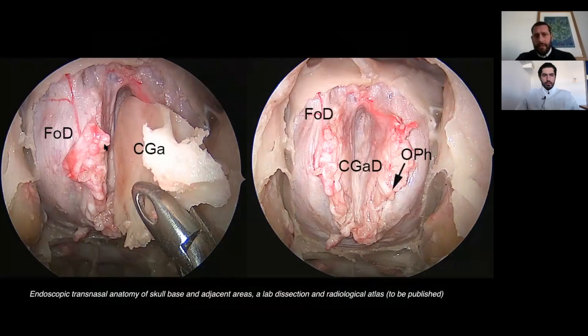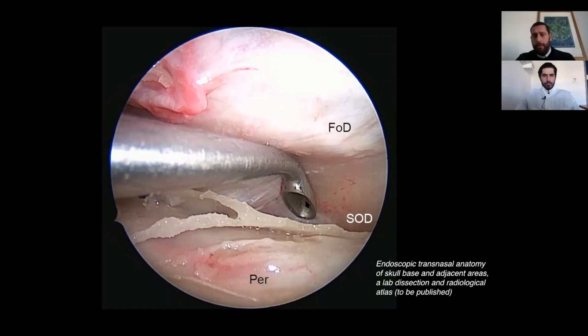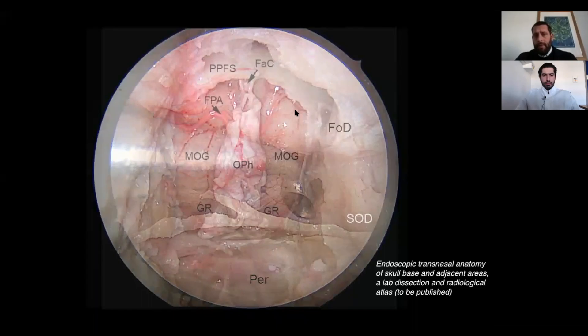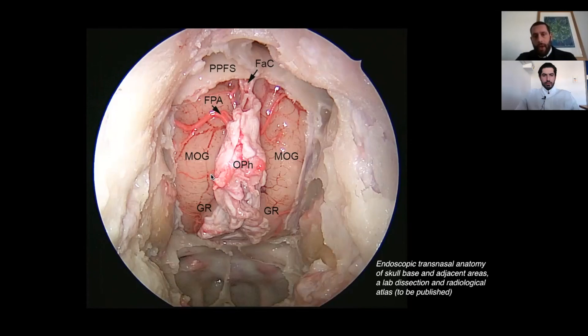Removal of the crista galli is another very important step; otherwise you cannot remove the dura when needed. This is the area where the crista galli was removed. Whenever you have to remove the dura, this is a critical step. You must always dissect the dura very well from the surrounding bone at the margin of your bone defect, because after removal of the dura it will be very difficult to place your reconstruction layer if you haven't done this dissection beforehand.